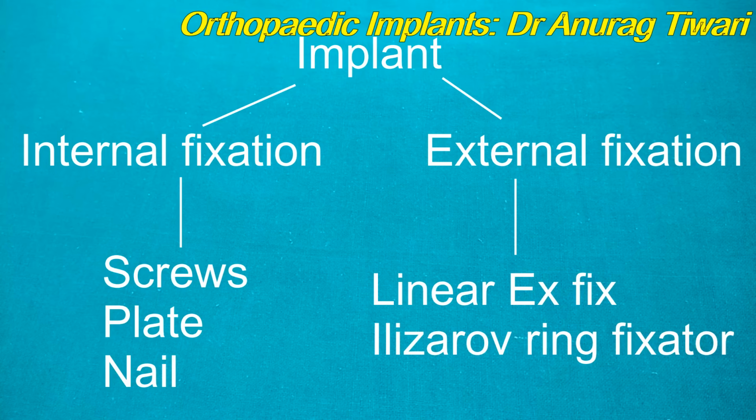And the external fixation is mainly the linear type of fixator, what we use, the AO type of external fixator, and the ring type of fixator, that is the Ilizarov fixator.